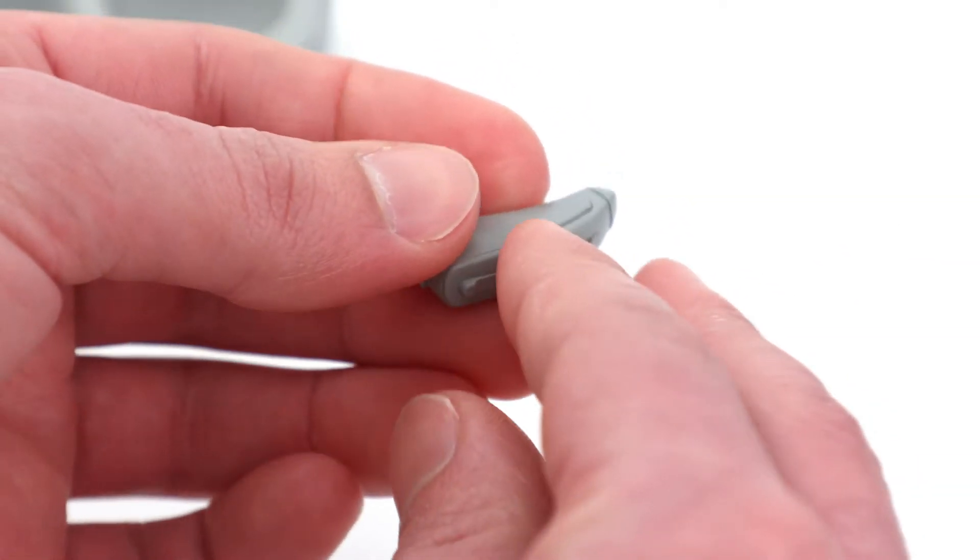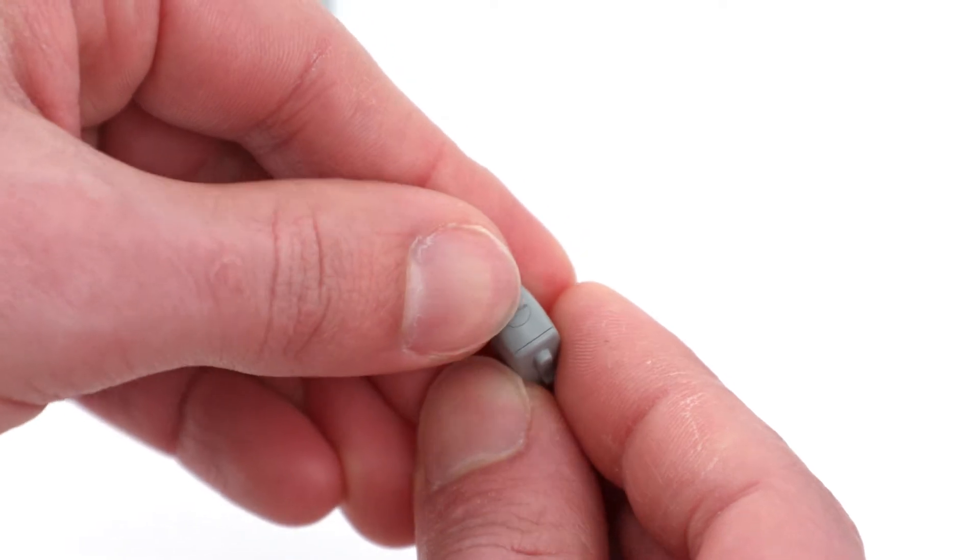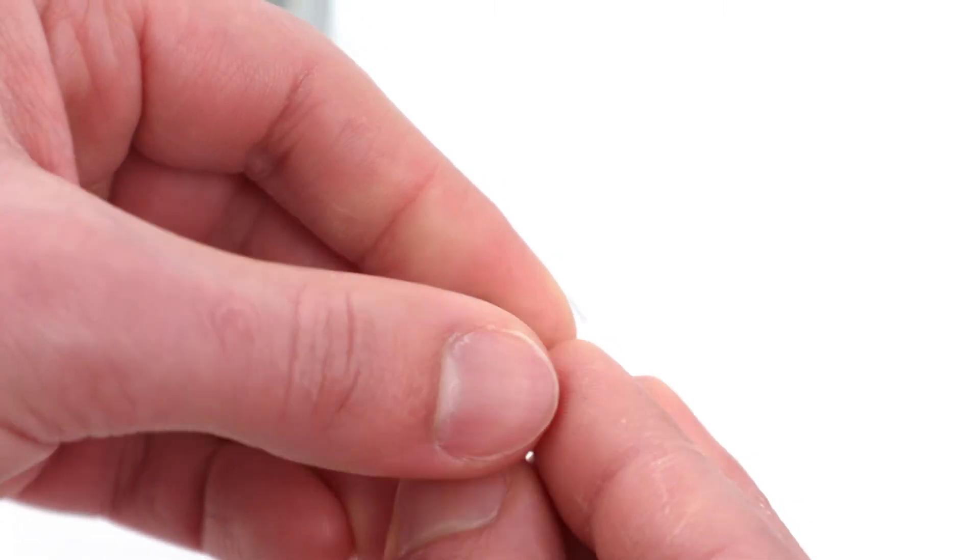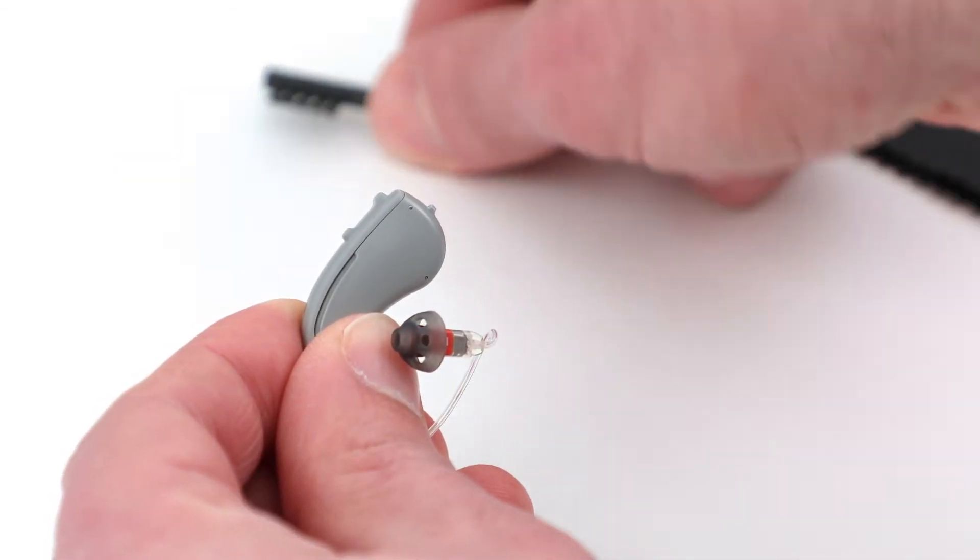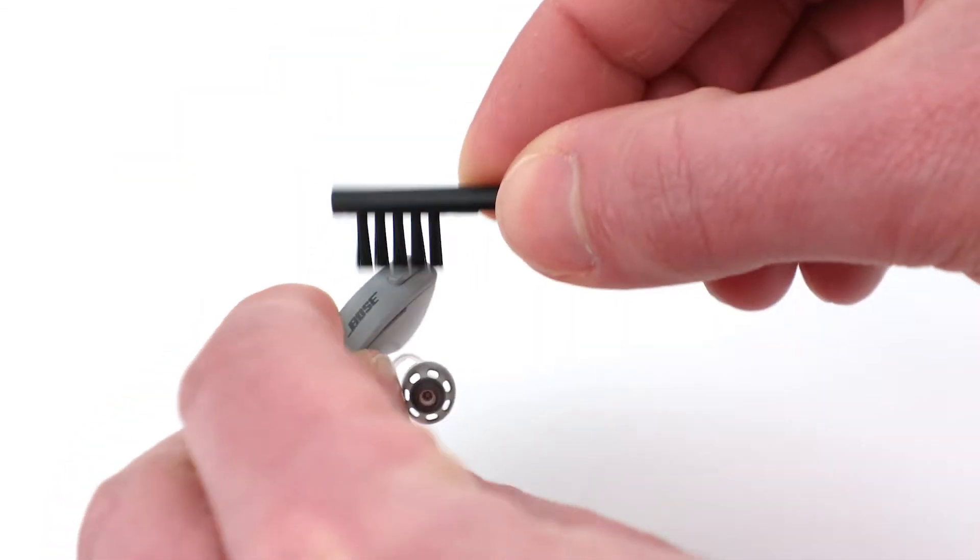To power off the hearing aid, partially open the battery door until you feel a click. Partially opening the battery doors will power the hearing aids off, preserve battery life, and prevent the batteries from falling out.